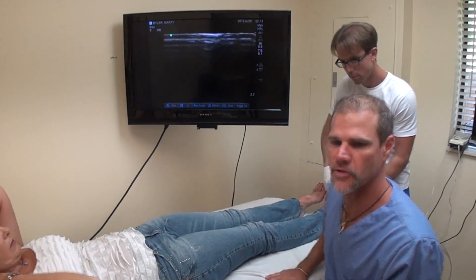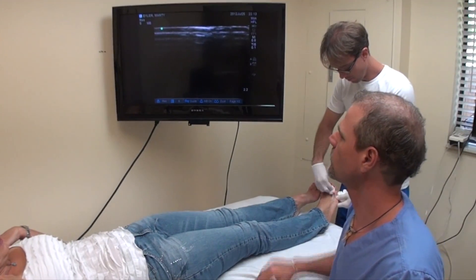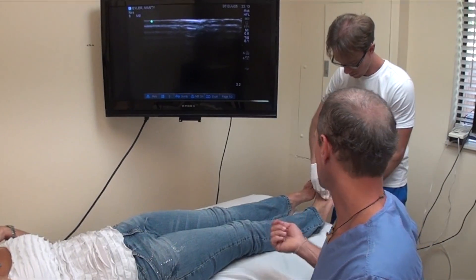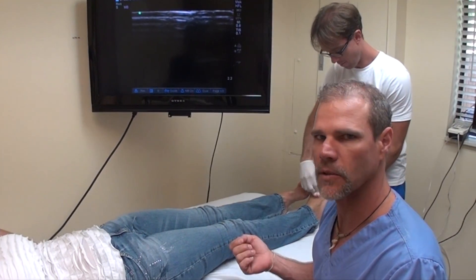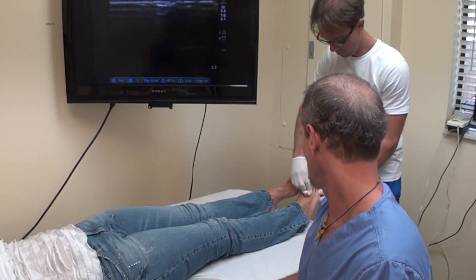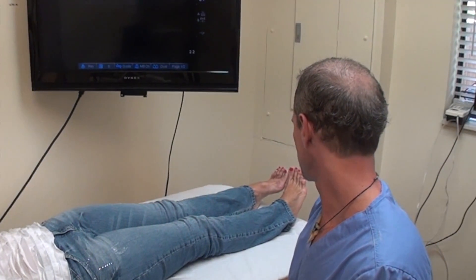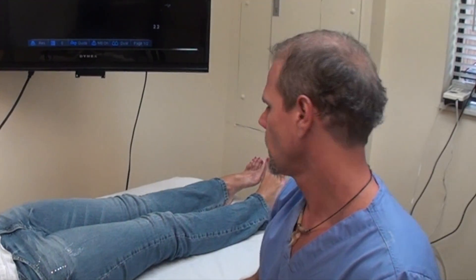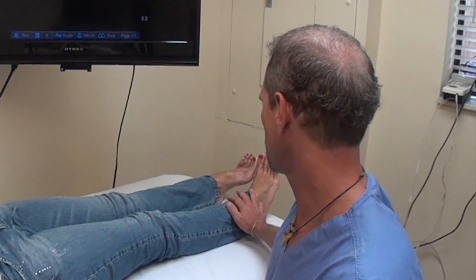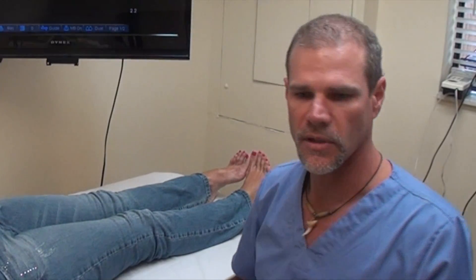Today we're going to be doing something called hydro dissection to a Morton's neuroma, and we've got the ultrasound screen up here. We're going to be guiding an injection of something called D5W into the sheath around the nerve. What we're looking to do is release the connective tissue adhesions around that nerve to give her some relief. In addition, this patient will also get orthotics to correct for a drop metatarsal head and chiropractic care for her low back, pelvis, and knee. So this should be very successful.